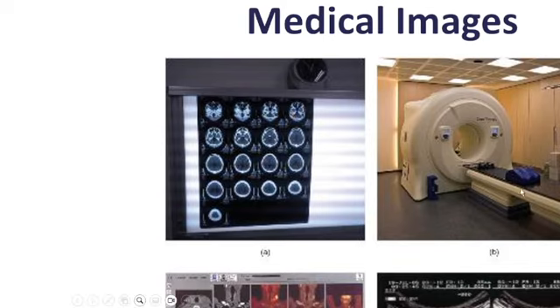In a CT scan, the patient lies on a platform while the computerized tomography machine generates multiple X-rays as it rotates around the patient. These X-rays, or slices, are then assembled into a very detailed image, and soft tissue masses can be measured using the CT scan to the millimeter, with the drawback of large radiation exposure.